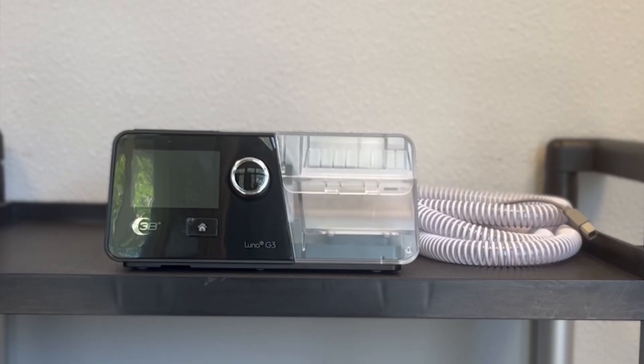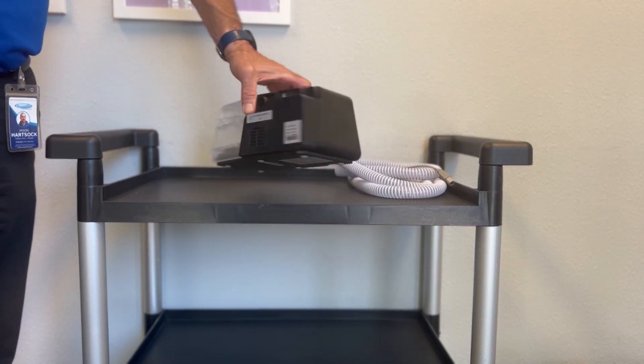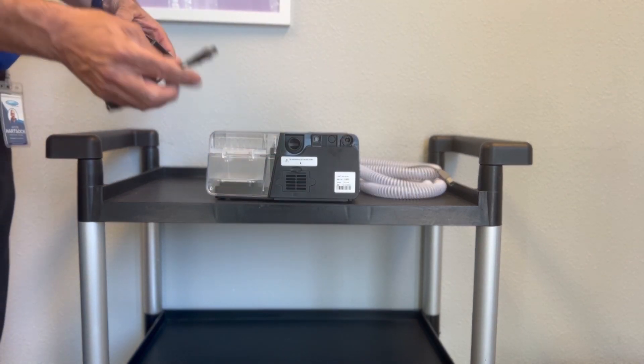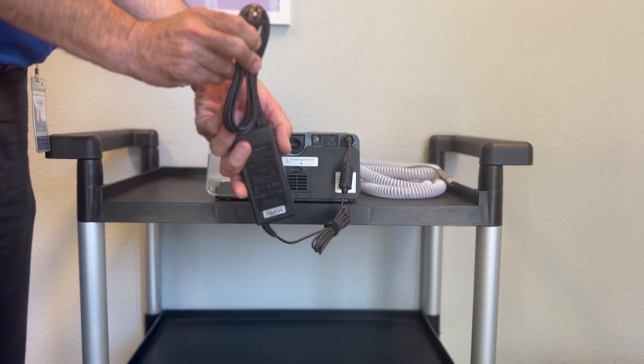After unboxing your Luna G3 PAP unit, the first thing you want to do is plug in your power supply. Turn around to the back here — here's your power outlet — and take the other end and plug it into your wall outlet.